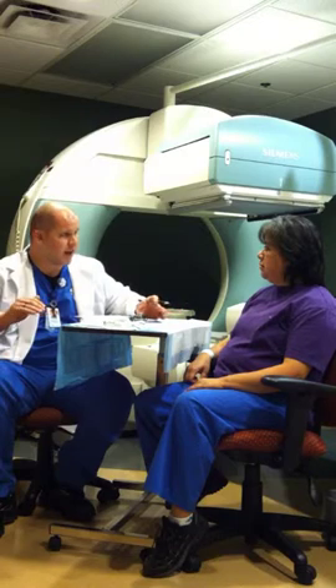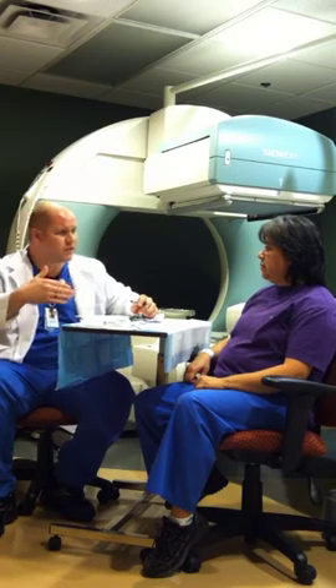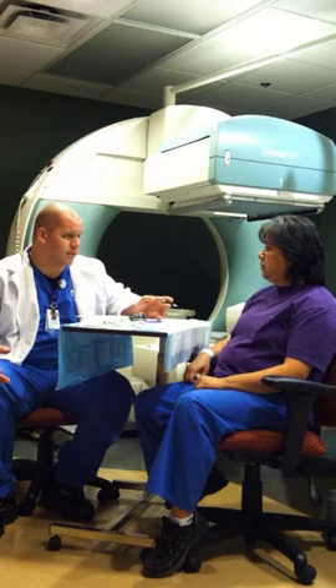Do you feel comfortable about laying down for about 30 minutes? That should be fine. If it's an issue, between different views we can let you get up and stretch your legs. We'll work with you to try to keep you comfortable. You'll have the free wires on there and we'll change the views as necessary. You can even go to sleep if you like — we'll try to keep it nice and quiet and comfortable for you.